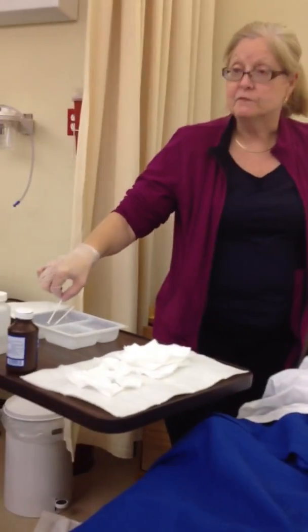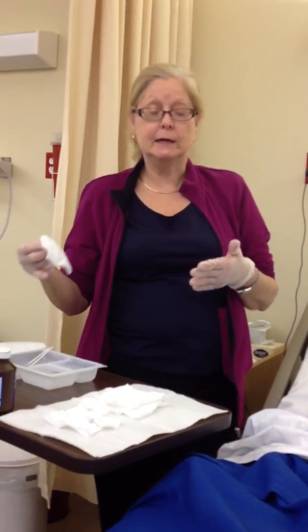So everybody following so far? And I'm dropping. So now we've washed it, and that was with our 50-50, the hydrogen peroxide. We washed it. So now I'm going to go into the same normal saline, the same saline that I rinsed the trach in. So even though it probably looks really yucky, it is still the patient's own flora.